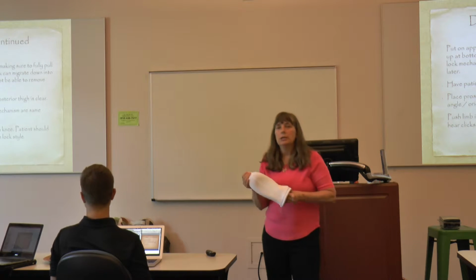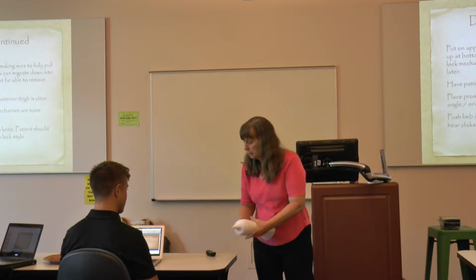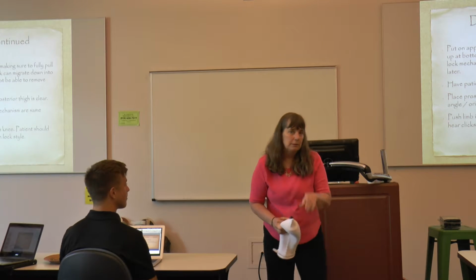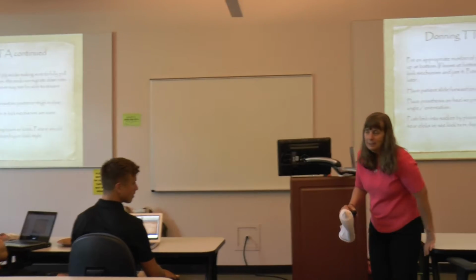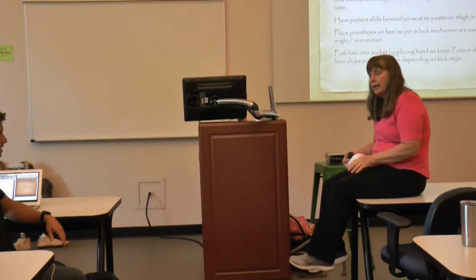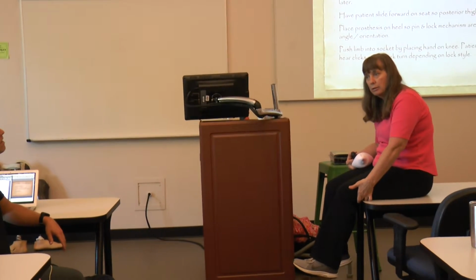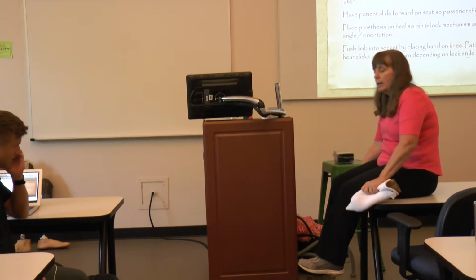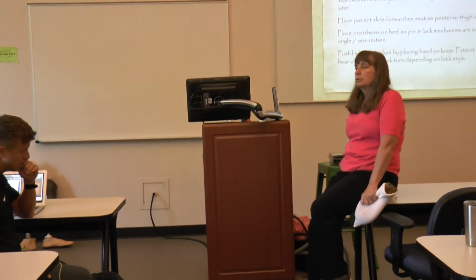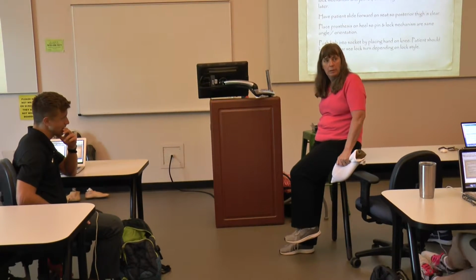Okay, so once you get your ply socks on, now you want to have the patient scoot to the front of the chair. I need you to pan over here, because I have to sit down up here instead of sitting in the way. Right now, if I need to push my knee towards the ground, I can't because I'm hitting the back of my chair. So next, have them scoot out enough that I can actually push my knee up and down.